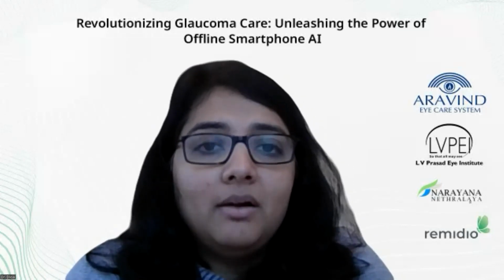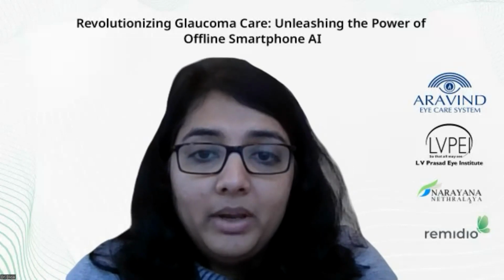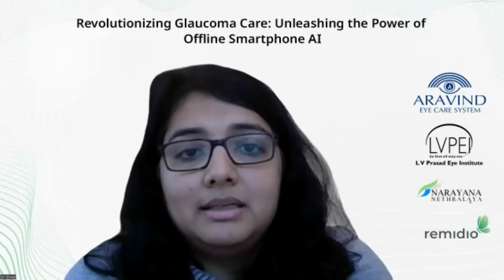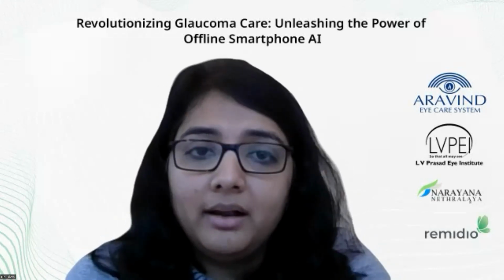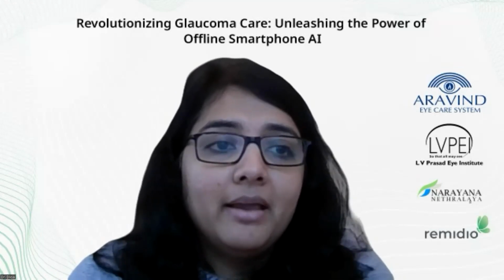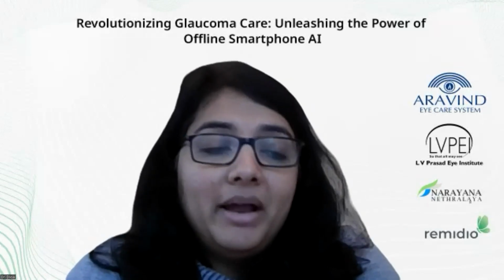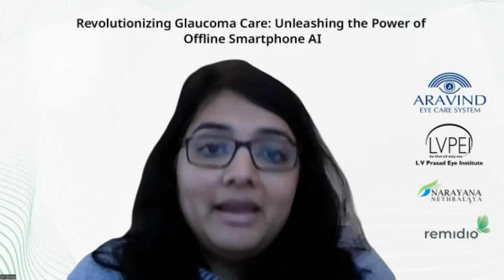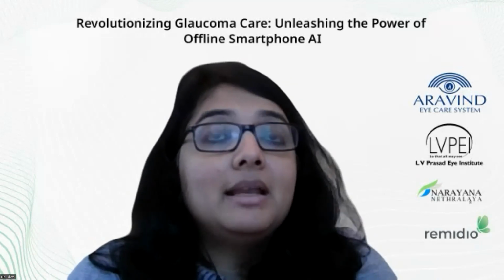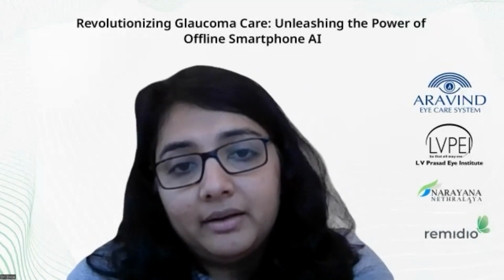So we need to be cognizant of the fact that, at the end of the day, the clinical judgment of the ophthalmologist is essential, especially in the hands of an ophthalmologist. At the end of the day, it will be the ophthalmologist's decision. For autonomous use in the community, I think we are looking at the benefit of those who have missed screening itself. The entire cohort is not getting screened, so you are going to identify those who are missed. But there again, the final diagnosis will lie with the ophthalmologist to whom the patient is eventually referred after the initial screening. But if there is no oversight of an ophthalmologist at the time of screening, I think the liability will have to be taken on by the AI manufacturers.